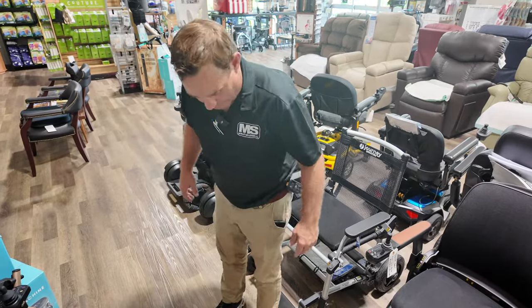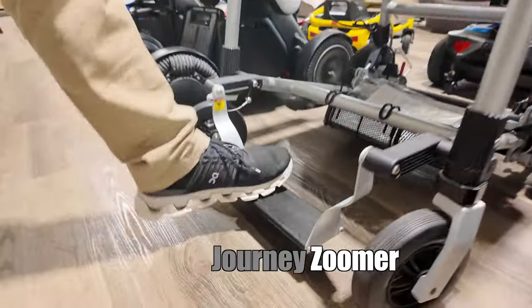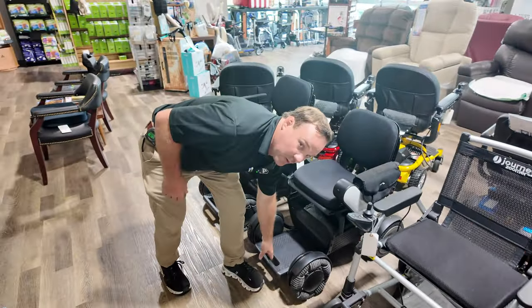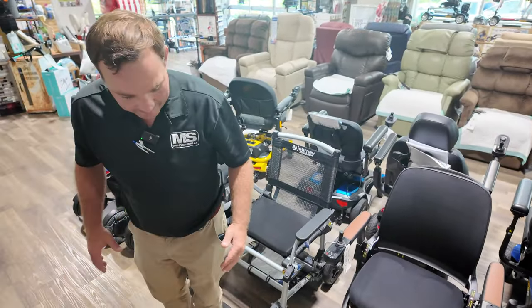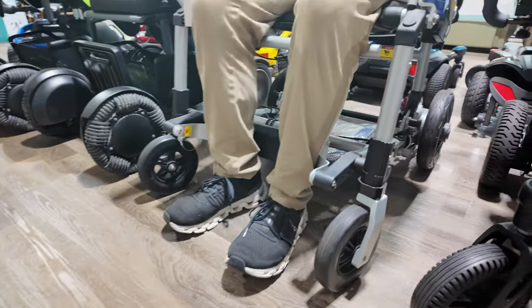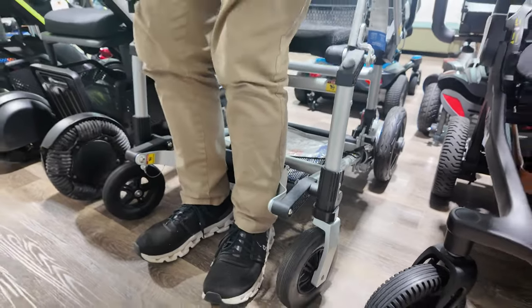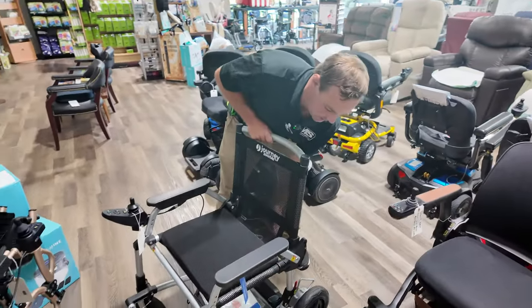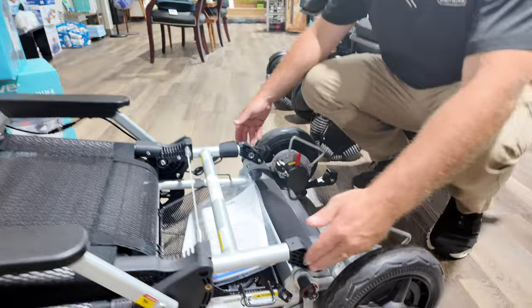I brought the Zoomer in — they've changed some things. I didn't like this footplate at first, but I can tell you why it can benefit you. Out of all the other chairs, all the footplates have to be manually brought down unless you use a swivel seat — and these don't have swivel seats. If you have a hard time remembering to put the footplate down or can't bend over, this is very helpful for getting in and out of the chair. It's very lightweight and can fold down.